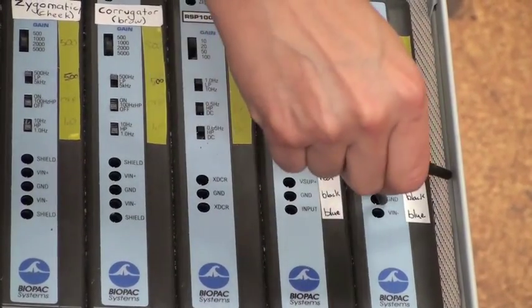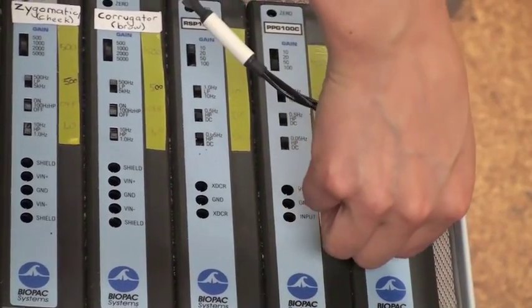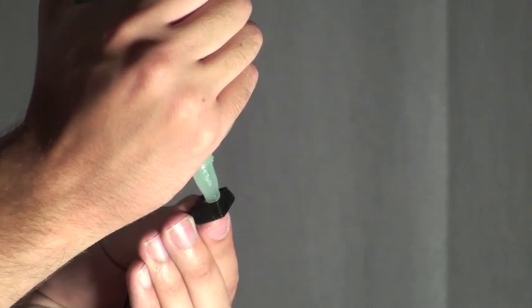The two blue cords plug into the outer two outlets. You will only use the middle plug for a ground if you aren't already using one for EMG. Next, place electrode gel directly into the electrodes and try not to get any gel on the surrounding area.